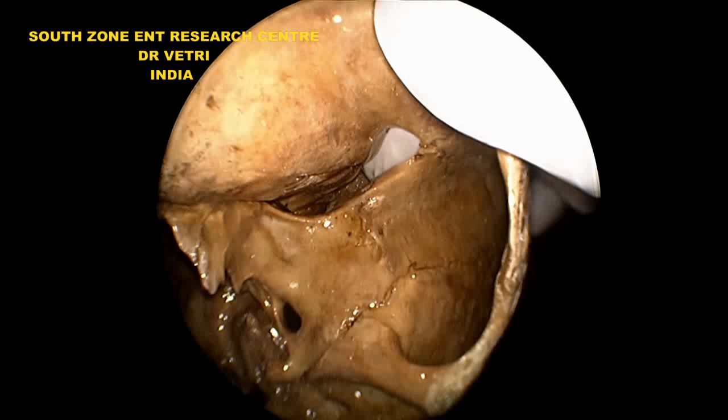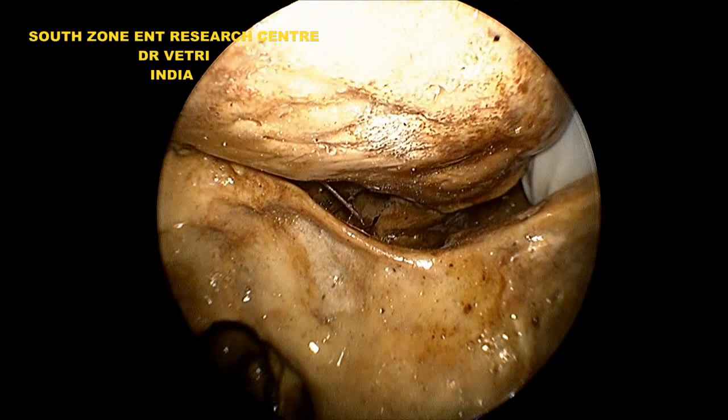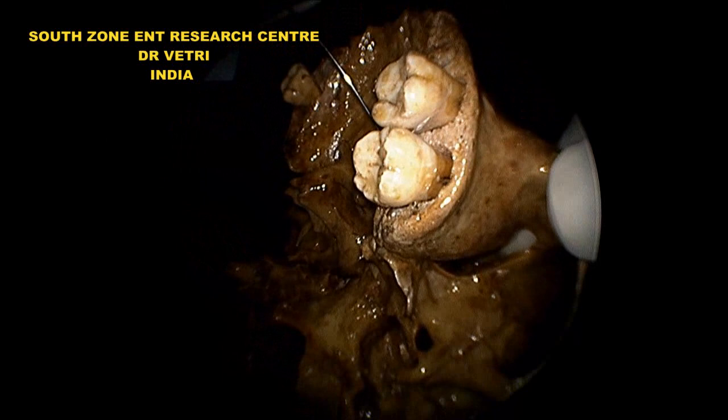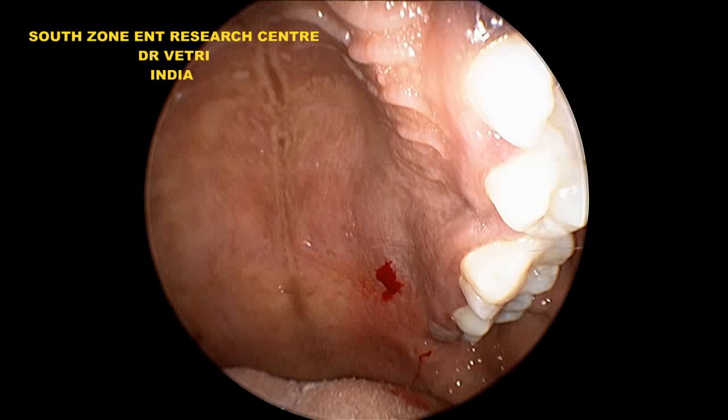This shows the block of the pterygopalatine fossa through the greater palatine foramen. The needle has to go 1 to 2 centimeters inside the greater palatine foramen with an angulation of approximately 45 degrees to enter the pterygopalatine fossa, where 1 to 2 ml of 2% xylocaine is infiltrated. This gives adequate anesthesia for approximately 1 to 2 hours.